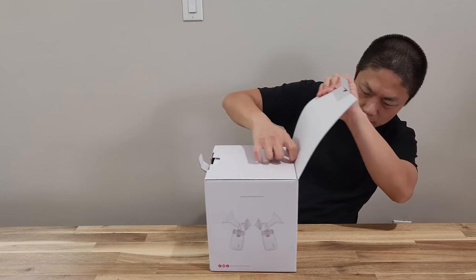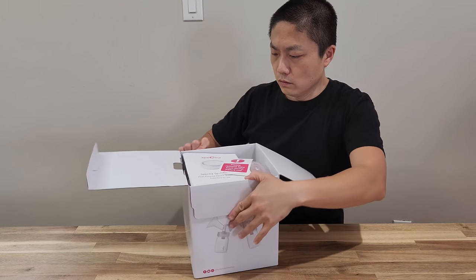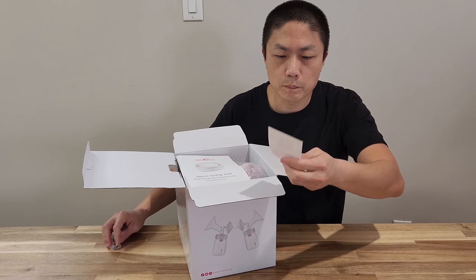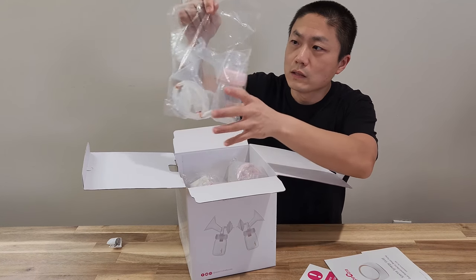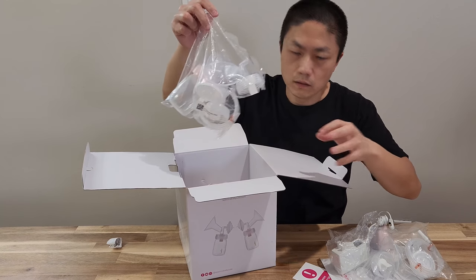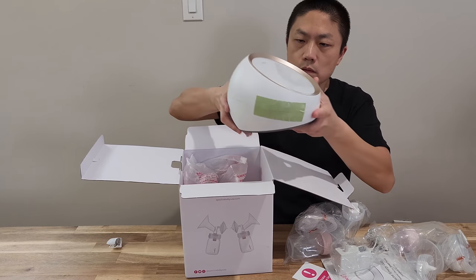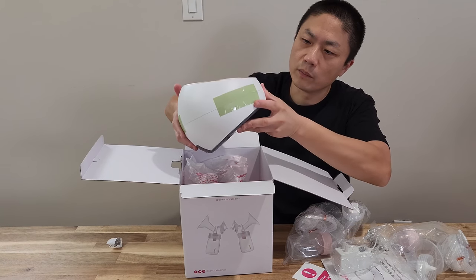So this is a Spectra SG Synergy Gold. Here we go — open it up. You will see a note: please remove tape from the pump before use. There's a manual, instructions, all the accessories, the charger, and another set of accessories. So two sets.